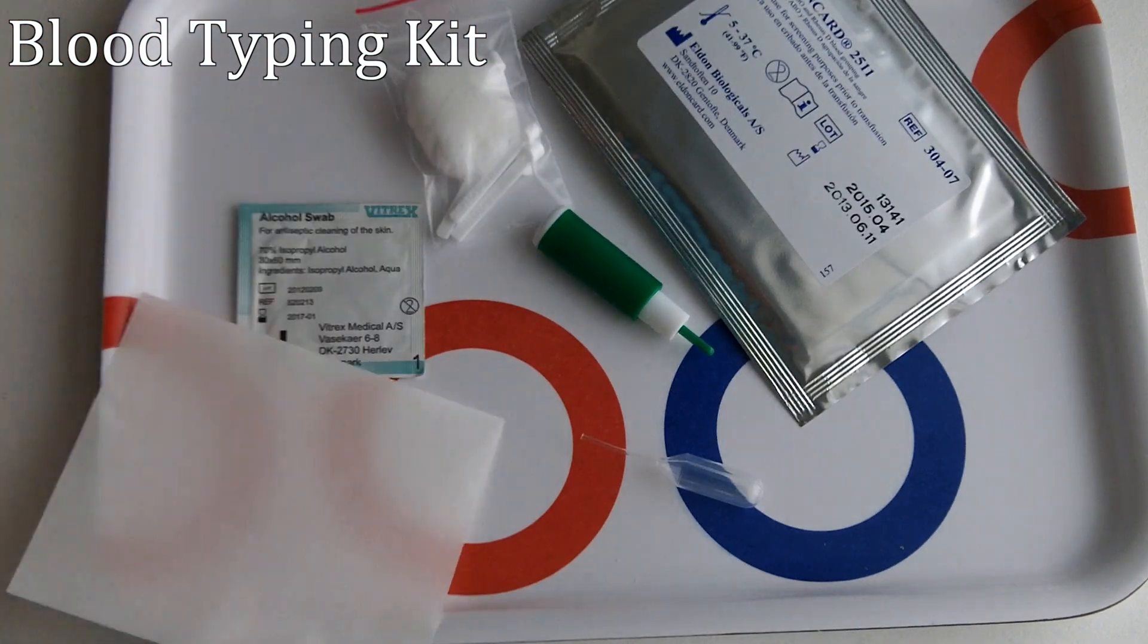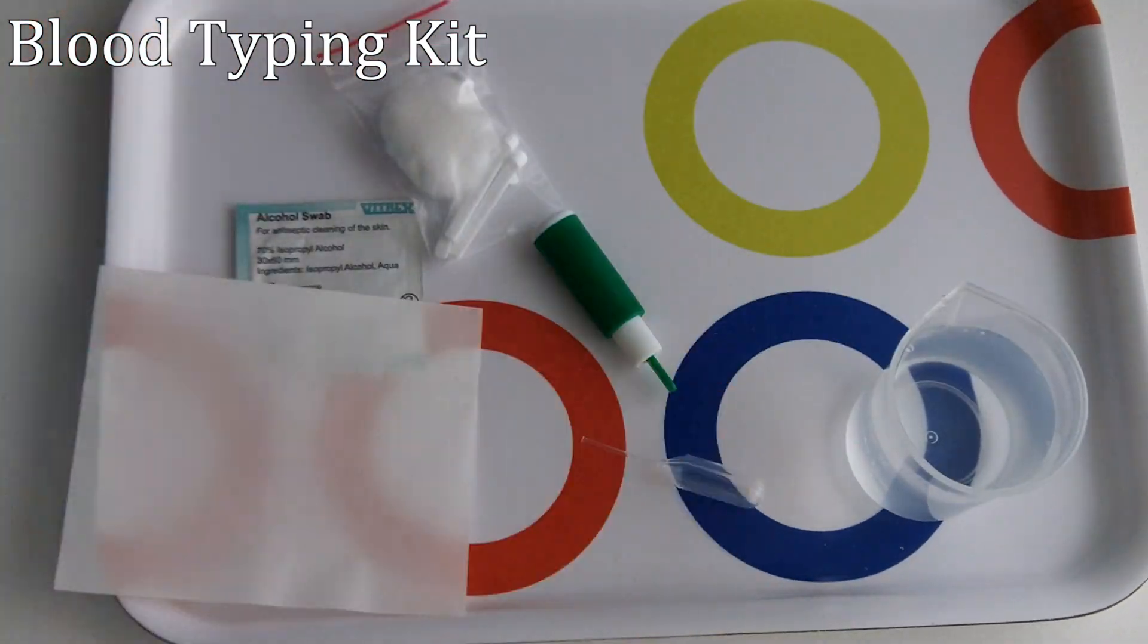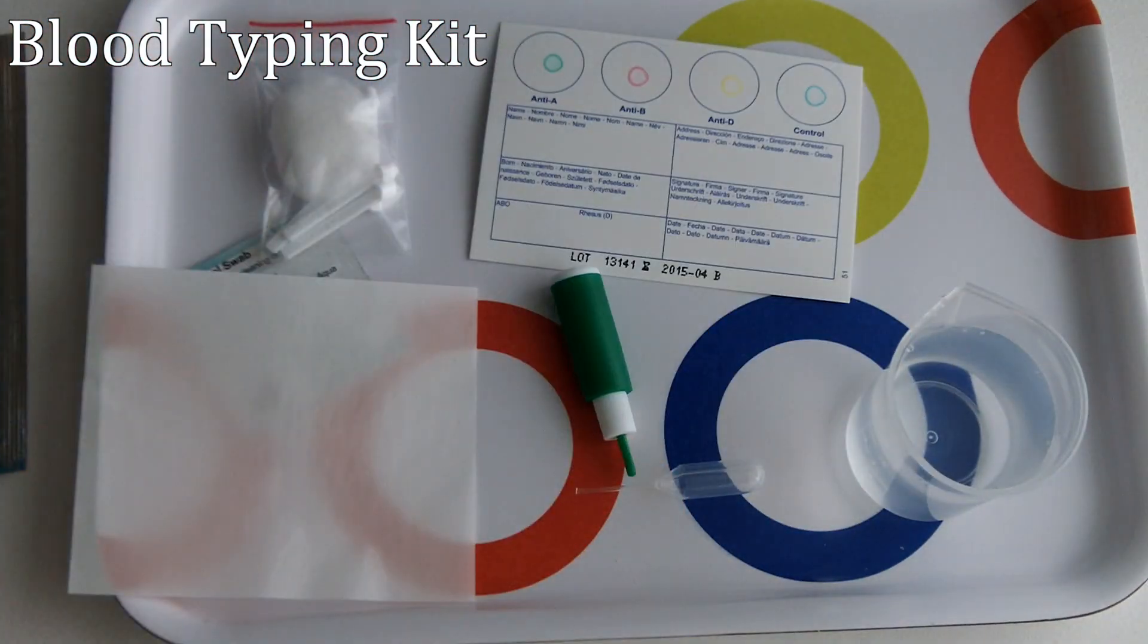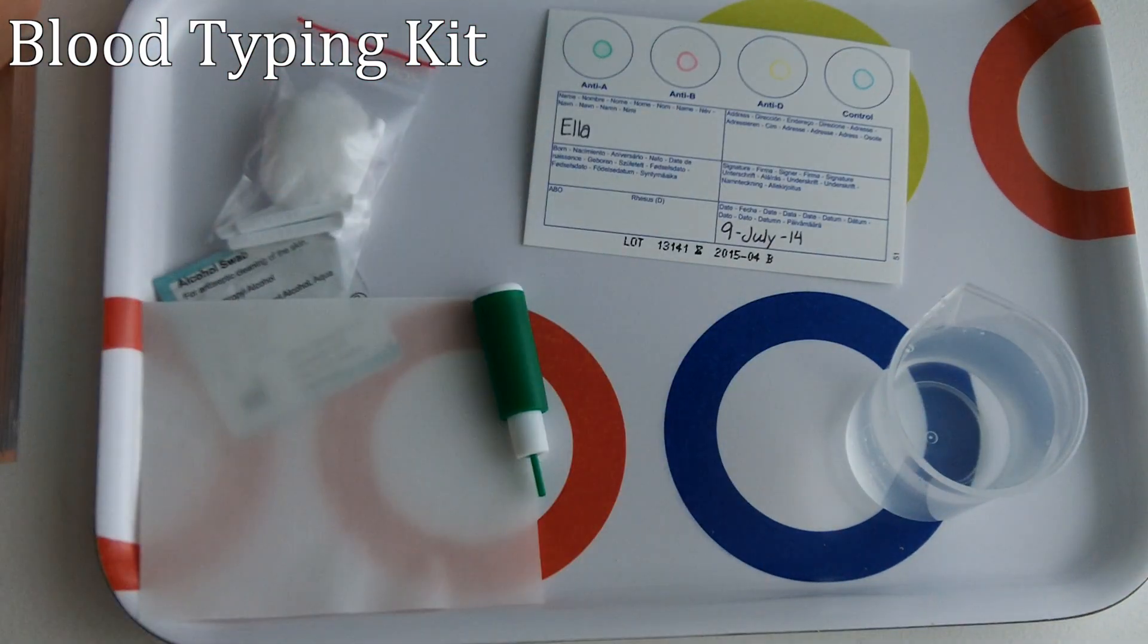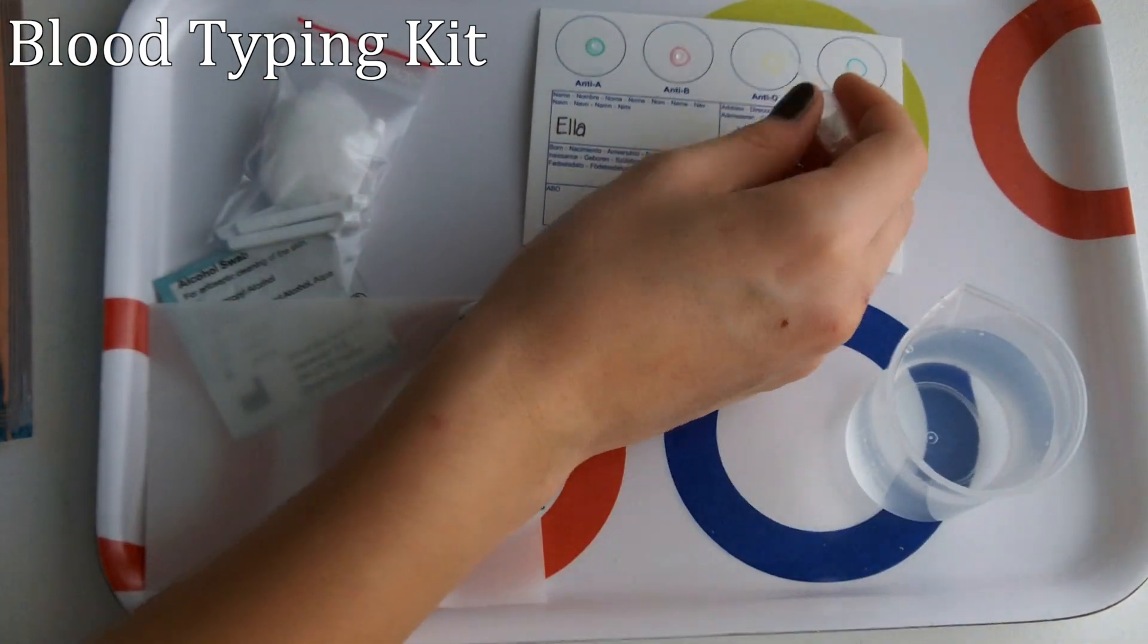First, I gathered the materials from the kit and the ones that the instructions told me to collect. Next, I pipetted a droplet of water into each of the colored circles on the card.